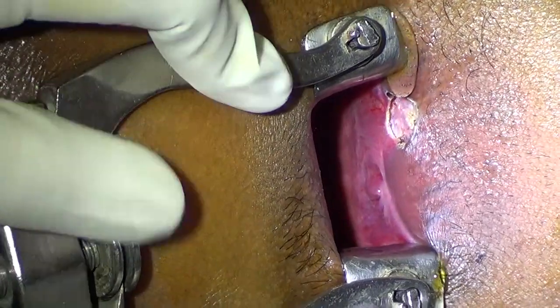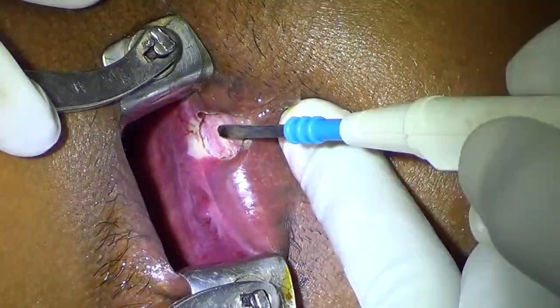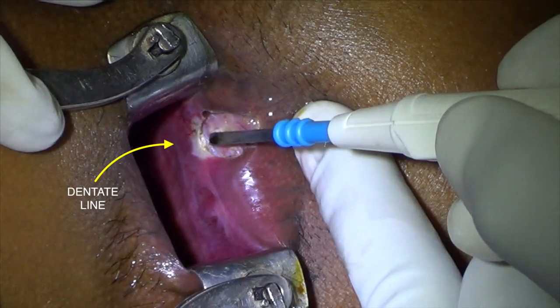Then coagulate at the proximal end of the incision. From this end only, you will get the immediate postoperative bleeding, so it is very important you coagulate. You can go up to the dentate line, but it is not necessary to go beyond the dentate line.